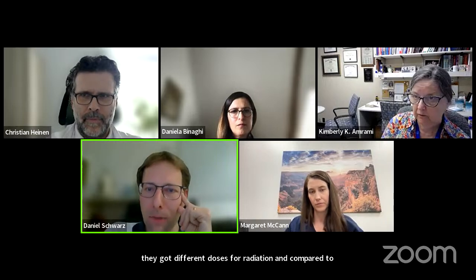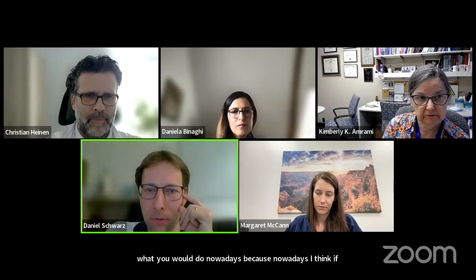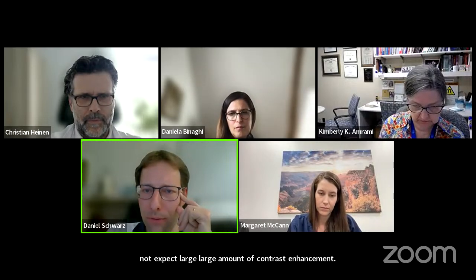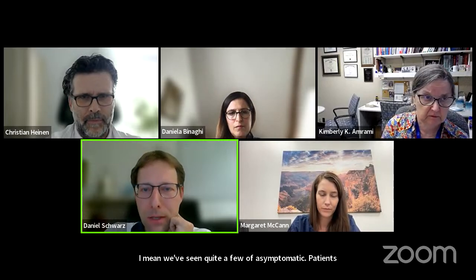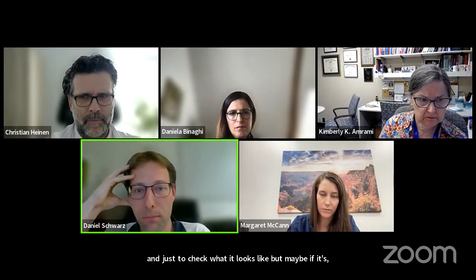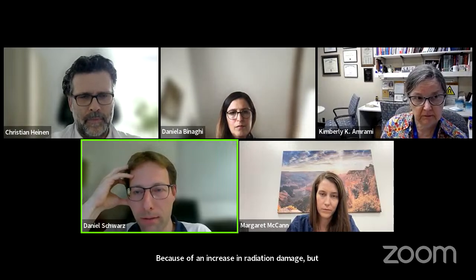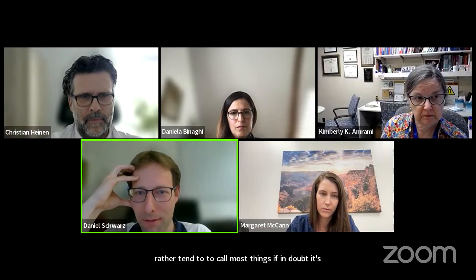Nowadays, in the normal radiation regime, you would not expect a large amount of contrast enhancement. We've seen quite a few asymptomatic patients, just to check what it looks like. But if it's years and years, it might be more difficult because of an increase in radiation damage. Still, if in doubt, I tend to call it the negative way.